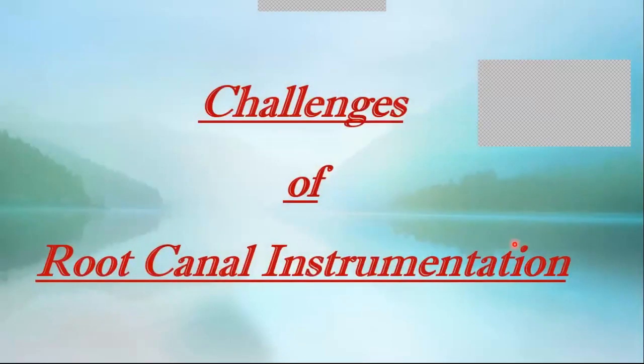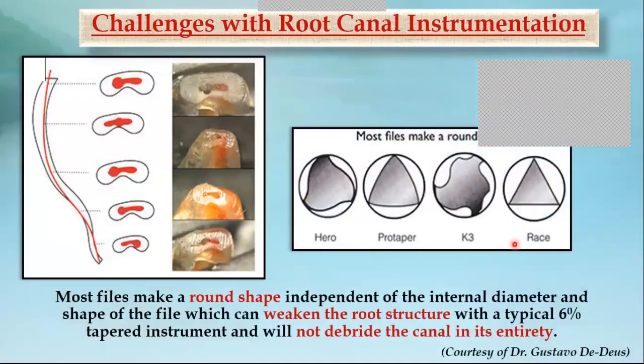And here come the challenges that we face during root canal instrumentation. Until now, almost all the instruments used for this task, either hand or rotary instruments, with their different geometric designs, have prepared the root canals in a round cross-section, resulting in up to 70% of the root canal space left uncleaned and unprepared. As we can see here, around this cross-section preparation in the oval root canal, leaving all these areas unprepared and uncleaned.